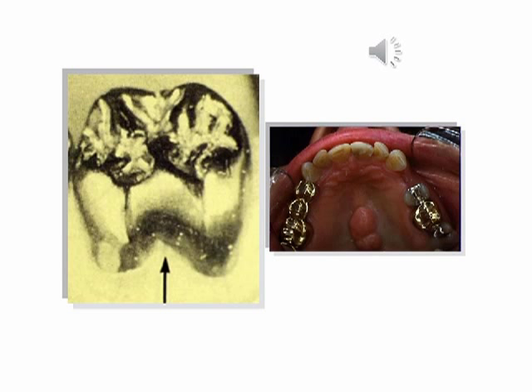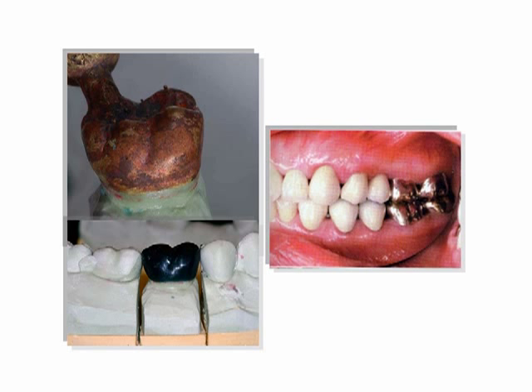Extensive removal of tooth structure, as with all complete coverage restorations, is required, with possible pulpal and periodontal sequelae. The metal hinders pulpal vitality testing. Type 3 or 4 gold is used in fabrication.